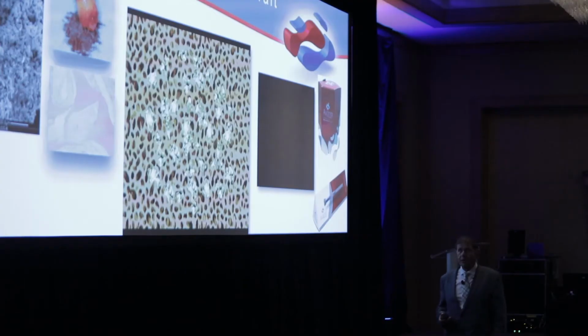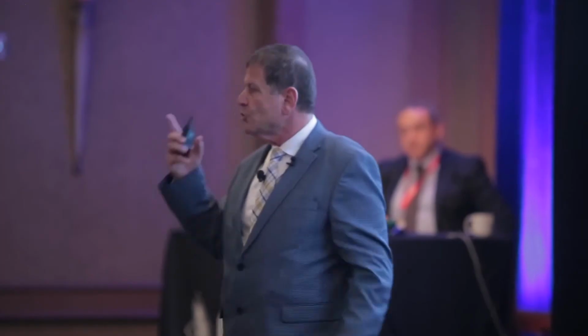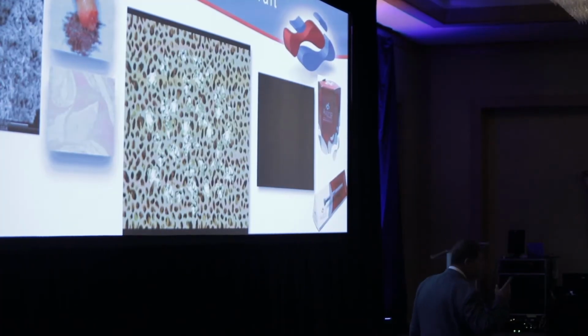One thing is important for me to stress: when you do a socket grafting and you work with cement, when the socket has 4 bony walls, you eject the material into the socket, press it firmly for 3 seconds, but don't use any tool to condense it down into the bottom of the socket as you used to do with granules. Because if you do so, the patient might experience pain similar to dry socket. This is not dry socket. It's due to the expansion of the cement.